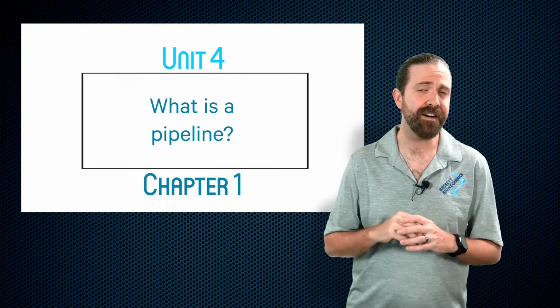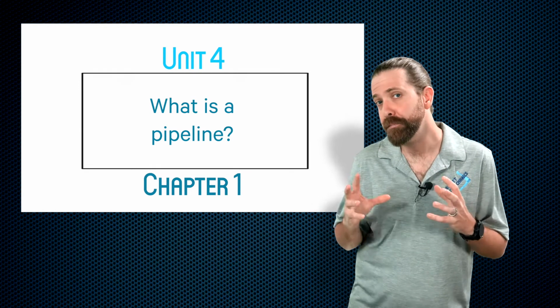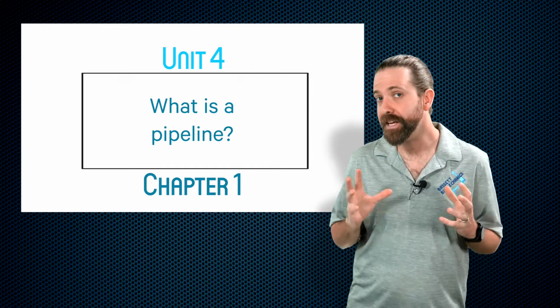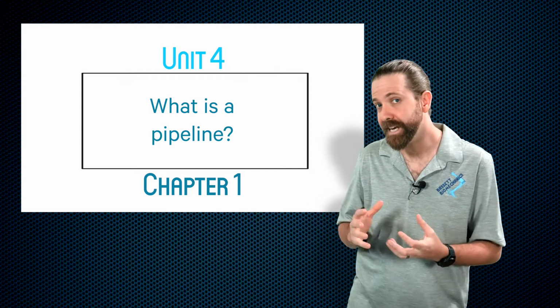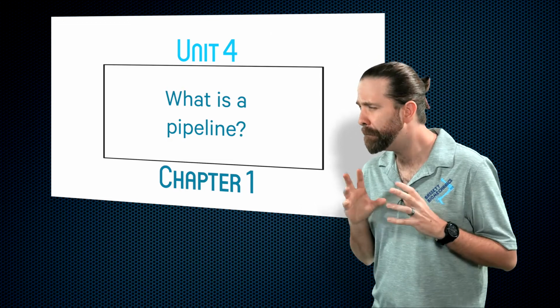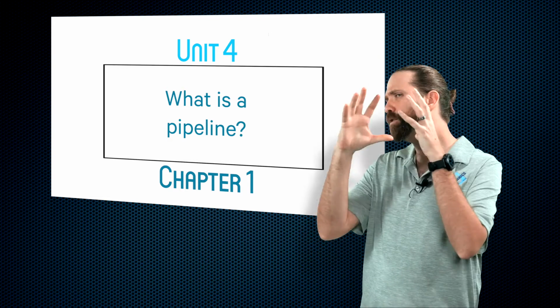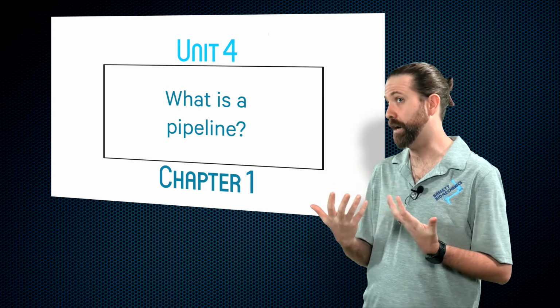So even if you have no programming background, you can use Visual 3D pipelines to create an automation of everything you need to do to process your motion capture data and obtain biomechanically valid results. Just to be clear what a pipeline really is, we want to give you a general overview before we actually get into how to do it.